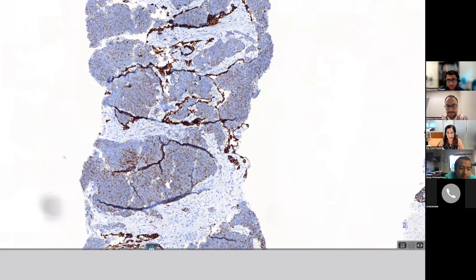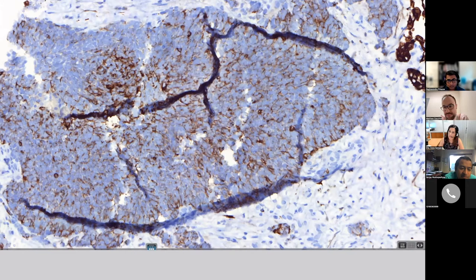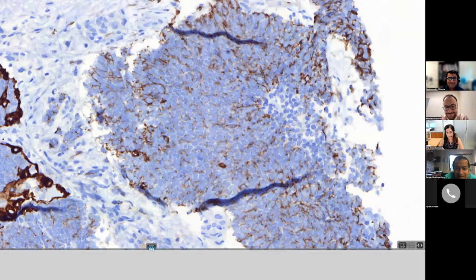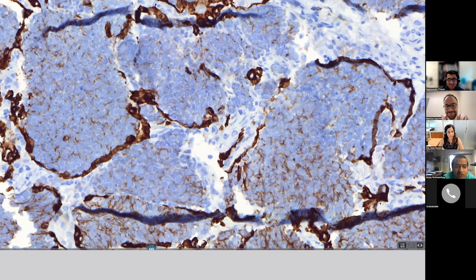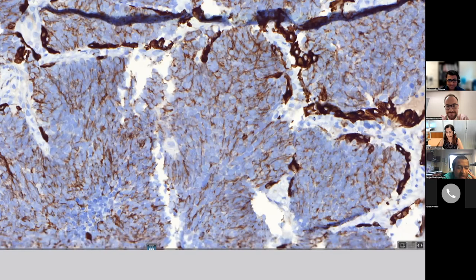This is, I guess, the normal alveoli, and these are the tumor cells. It's not membranous, but it's neither perfectly dot-like. Here we see some dots, but it's in the middle of membranous. I feel that the dot-like pattern is overemphasized in the literature. I don't care whether it's dot-like or not. It should just show that the cytoplasm is scant, at least when looking at small cell. The immunohistochemistry frequently supports your morphologic impression that there's very scant cytoplasm, so the staining is very minimal and delicate on a keratin stain. It's not always dot-like, and I feel that the idea that it has to be dot-like is wrong.